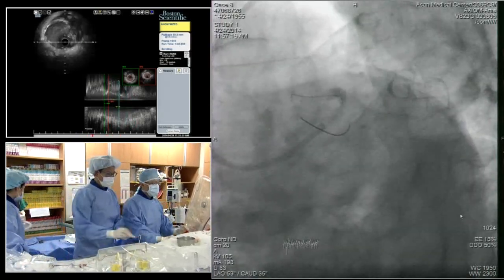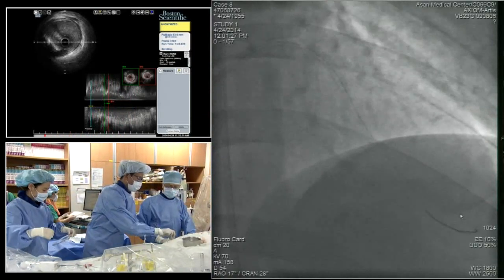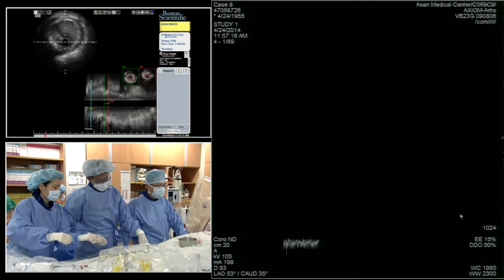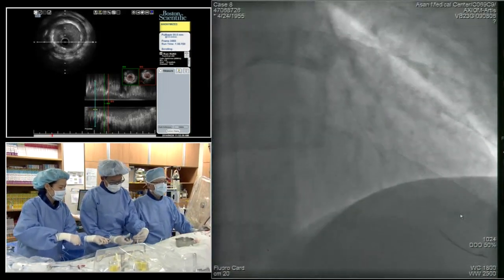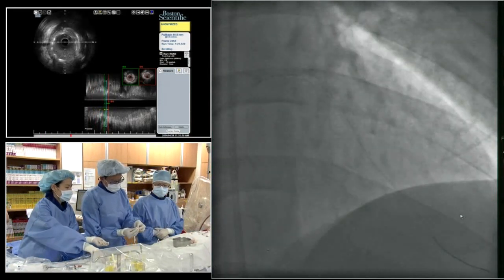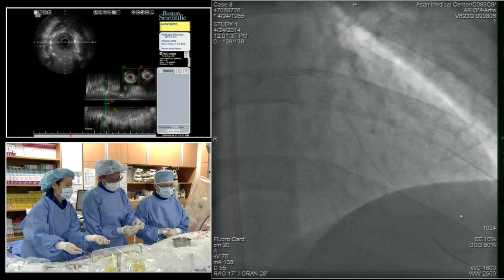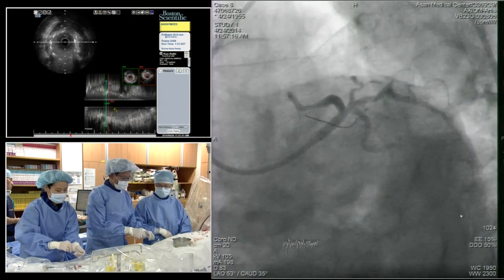I wanted to ask about this, Marty. So at least I heard, and I'm not sure if that's true, that when you put a very long stent, there is somewhat inhomogeneous deployment of the stent, even though it looks good in IVUS, just because the balloon is not able to exert a stable force on that stent, and that you should post-dilate with a non-compliant balloon, even if it looks good. Do you think that's true or not? No, I'm not impressed with that argument.